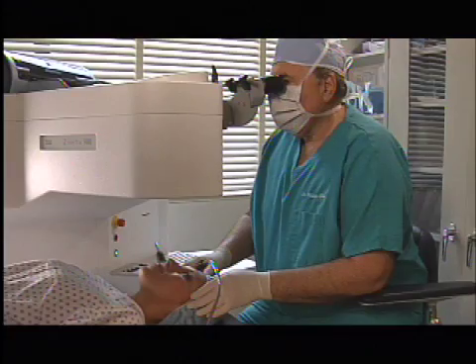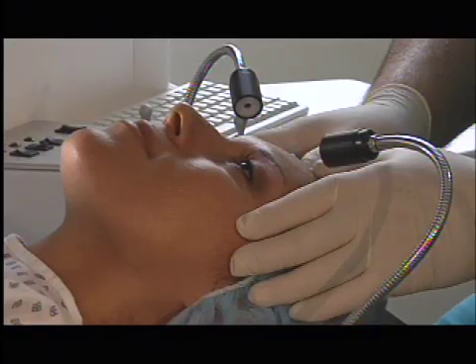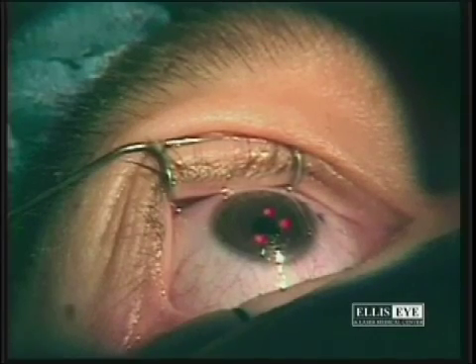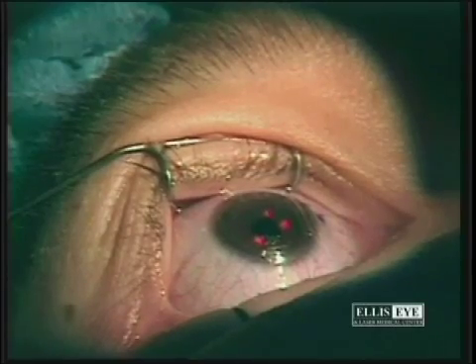So if you're nearsighted, farsighted, or have an astigmatism, these types of refractive errors are generally treatable with today's laser vision correction procedures. The type of laser used in laser vision correction is known as an excimer laser. The excimer laser is a cold laser that gently and precisely breaks the molecular bonds in the cornea that hold tissue together, vaporizing and removing small amounts of tissue, often less than the thickness of a human hair. The laser reduces the steepness of the cornea, bringing the light rays to a point of focus on the retina.